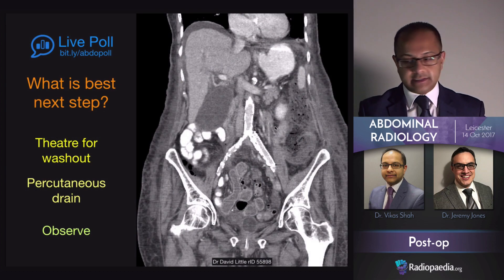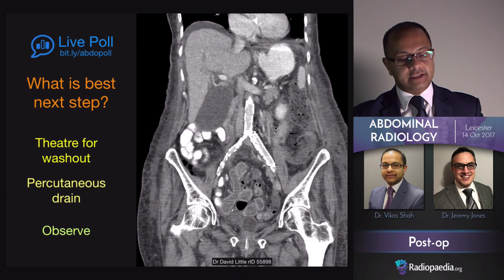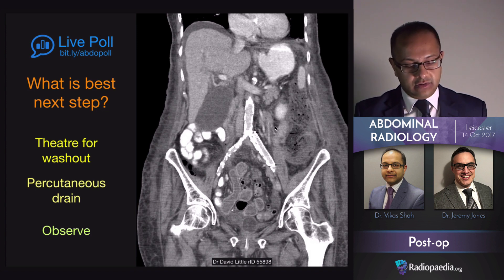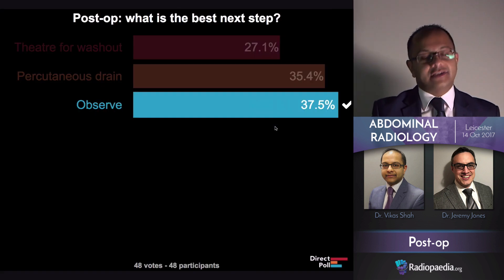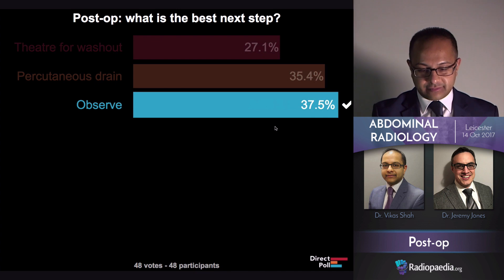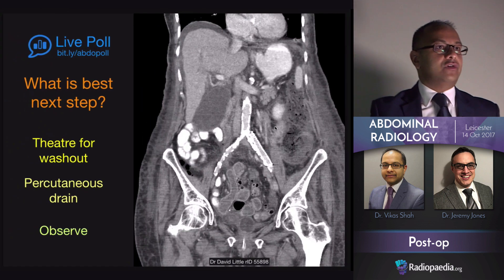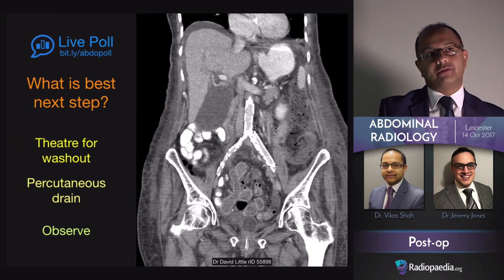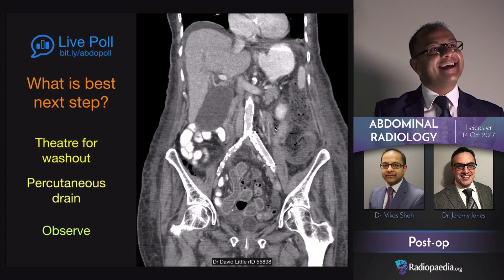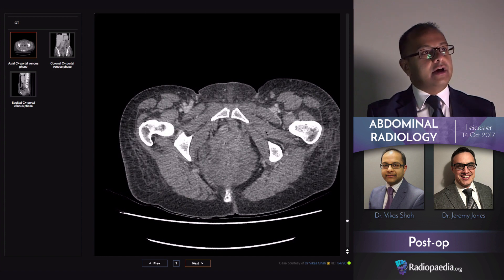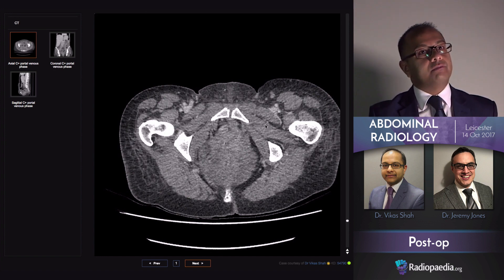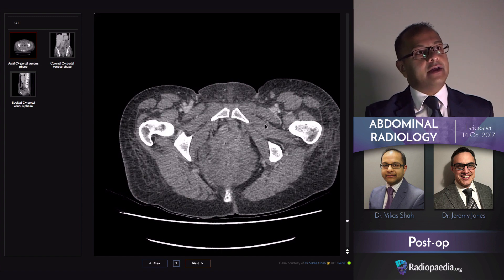What is the best next step? Is it to take them to theatre for washout? Is it to request and insert a percutaneous drain? Or is it just to observe? The correct answer is observe. Most of you got it right, but perhaps not for the right reason. The reason is something called Surgicel, which is a surgical haemostatic material that is placed to stop bleeding, and it looks very much like an abscess.